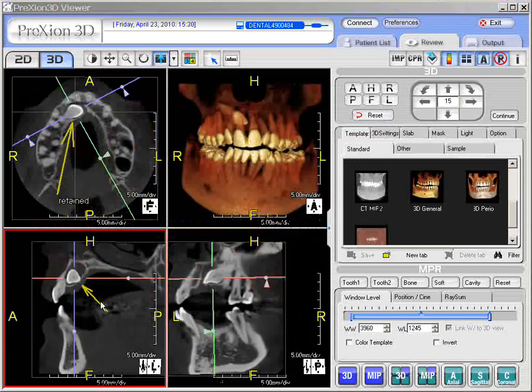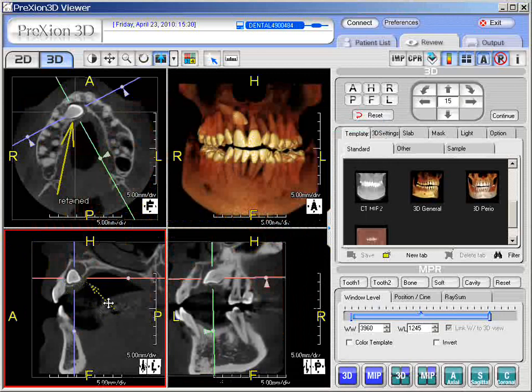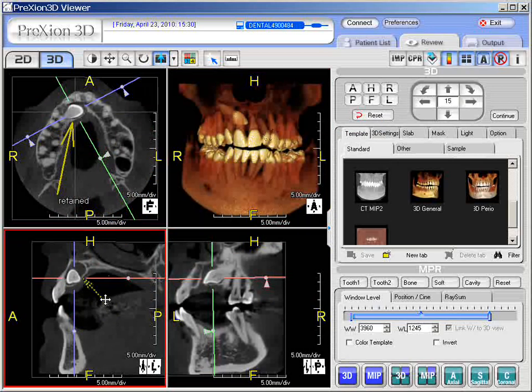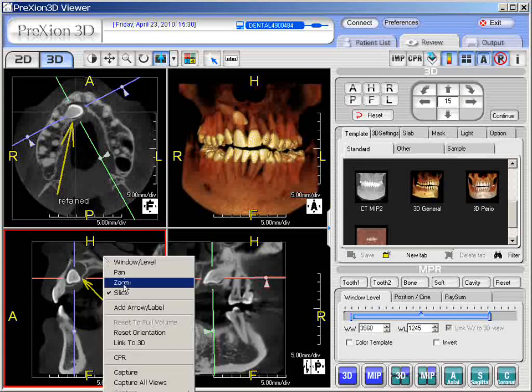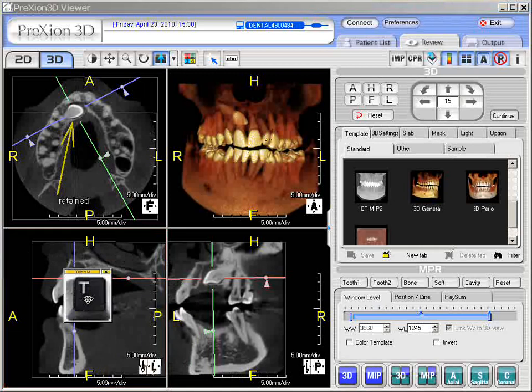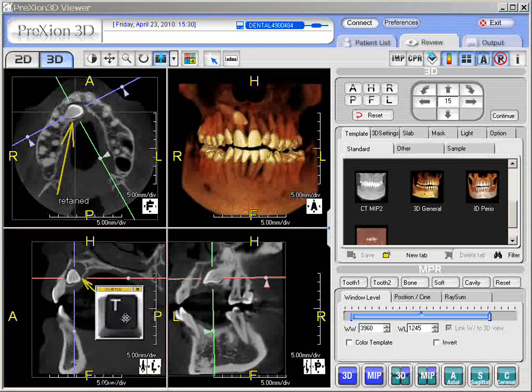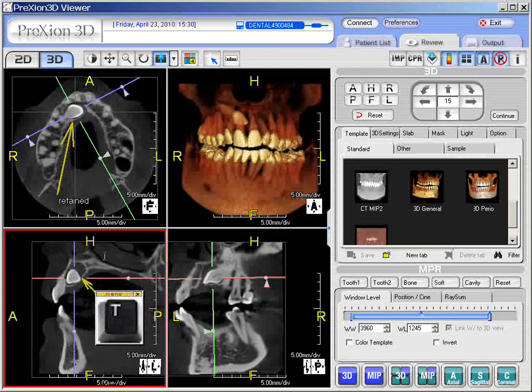Another feature is to move the arrow itself — click on it and you can move the arrow around if you want to use it as a pointer. So whether you put it in the 3D image or the CT, you have the ability to add arrows and text, either with right-click and 'Add Arrow Label' or by pressing T on the keyboard to write in the text.